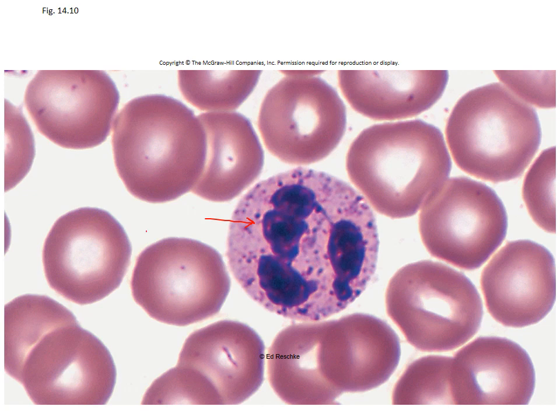Now again, these are the erythrocytes or red blood cells that are all around it. A couple of things I do want you to know about these. They are the most common type of leukocyte.